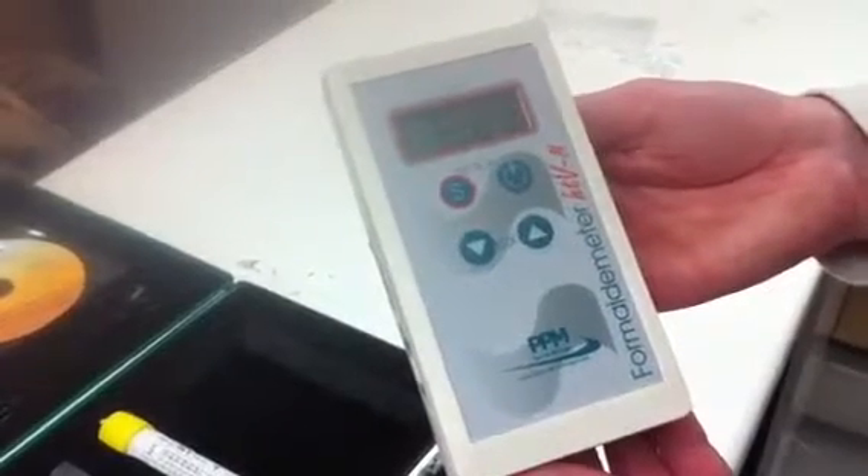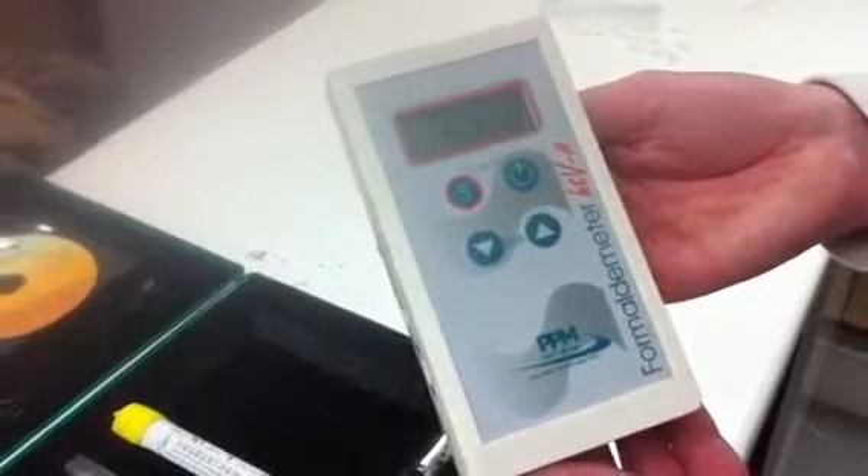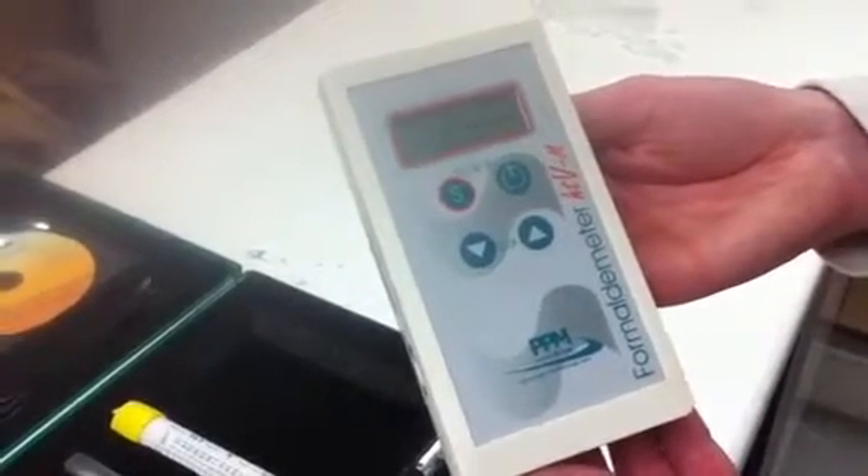You hear the pump run for about two seconds and the reading should be displayed within about 60 seconds.